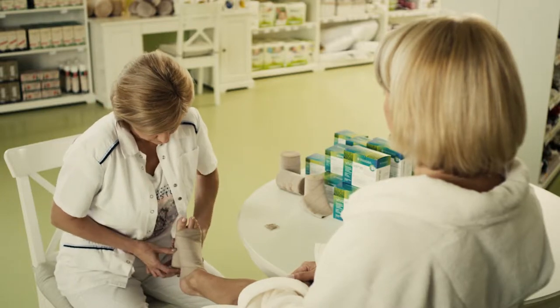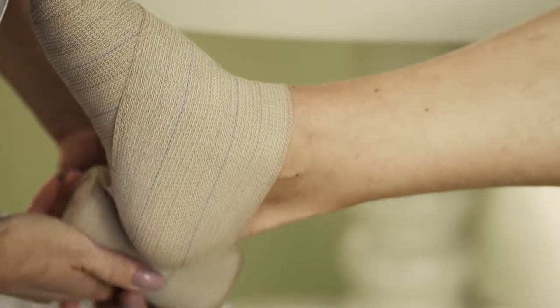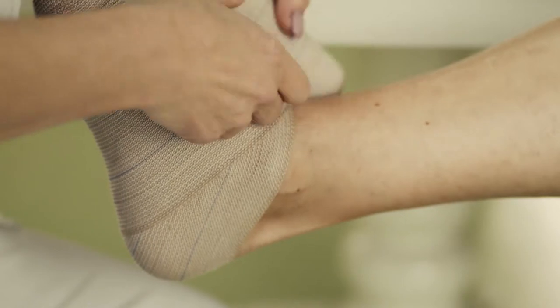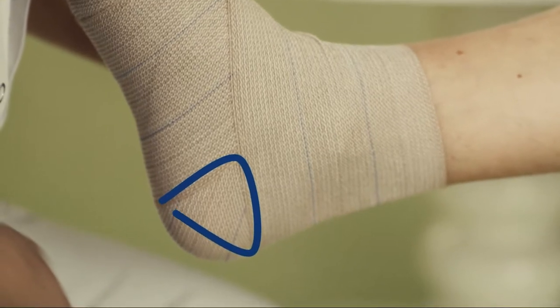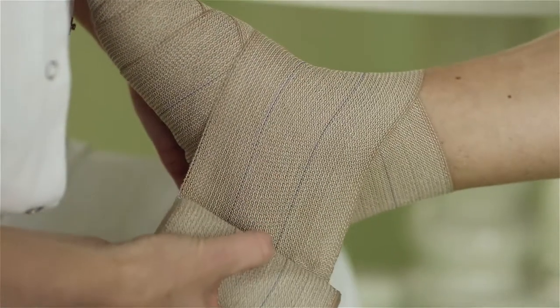The bandage must be wrapped over the heel at least two or three times. With the bandage we go over the middle of the heel, below it, above it, and then repeat. On the heel, make the so-called triangle. This way, we achieve that our bandage does not move or spread when walking.